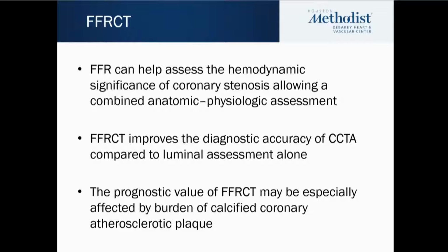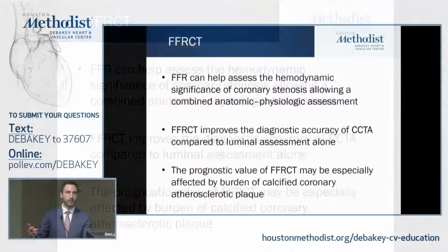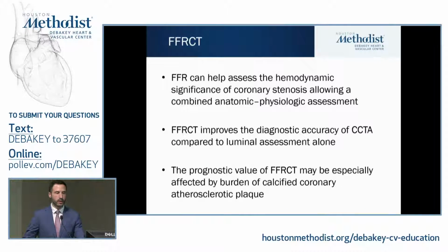So FFR, invasive FFR, has been very well described in the literature. We know the FAME trials have clearly shown that assessing the hemodynamic significance of a lesion can help with a combined anatomic physiologic assessment as compared to pure luminal stenosis assessment. With recent advances in CT, with multi-detector CT, improved spatial and temporal resolution, we now have the ability to do computational fluid dynamics on CT scans without any extra image acquisition. So these are all existing scans that get sent to a third-party vendor, and they can give us FFR CT.